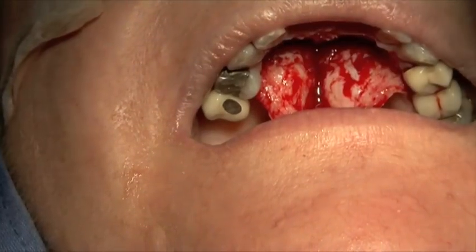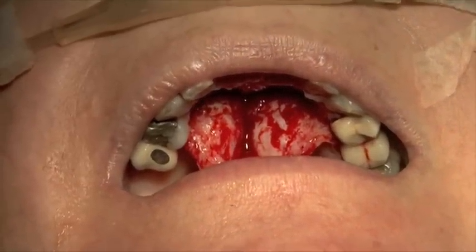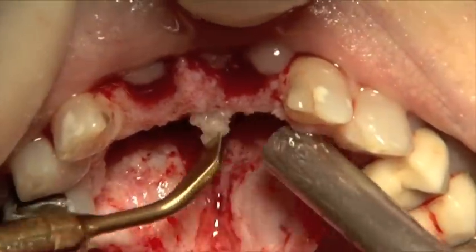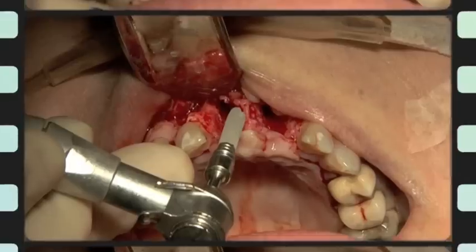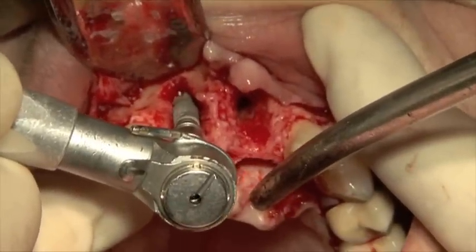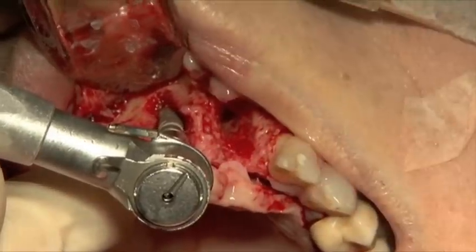Now we've got that — so we've got a nice bone around there. Just put a little bit more. Just going to collect a little bit more, because we have quite big defects, so I want to make sure I've covered every aspect of it. I've just hit 50 Newtons that quickly.